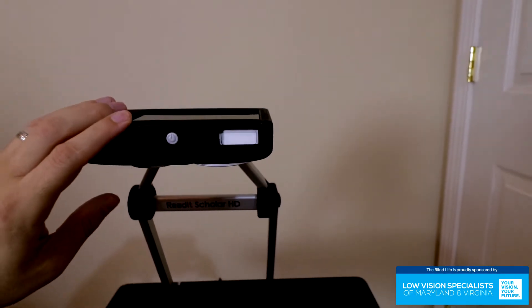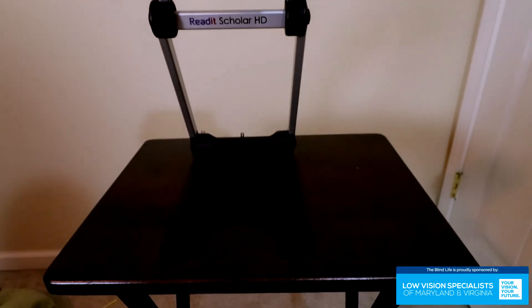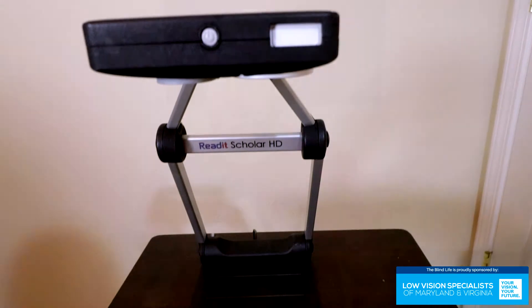The nice thing about this — and I'll have to figure out how it all works — but this camera, I was speaking with one of the representatives from Erie AT, and they told me you can pivot it to look at things in the distance. So if a student is sitting at their desk, they can turn it and face it up to see their professor writing stuff on the board — probably the whiteboard — and have a good look right there on their screen.